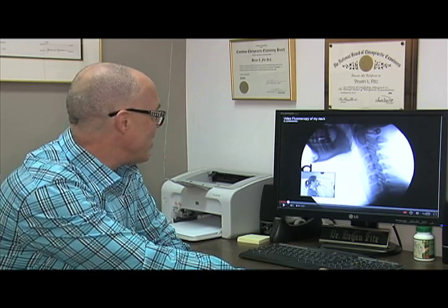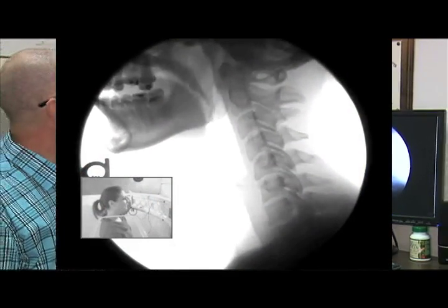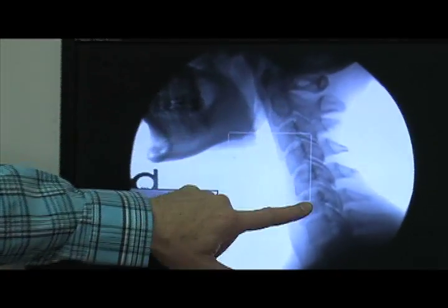And I think it's unique and beneficial for people to see what your body can do and what your body's doing inside, underneath all that tissue, the skin that you have, and give you appreciation for the ranges of motion of each bone as they move through time and space, and flexion, extension, rotation. So I'll point out the joints, the discs as this person's moving. Here's their jaw, their teeth, their jaw, and the neck. Flexing forward, you see the flexion.